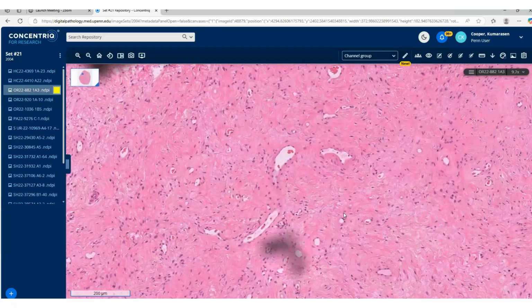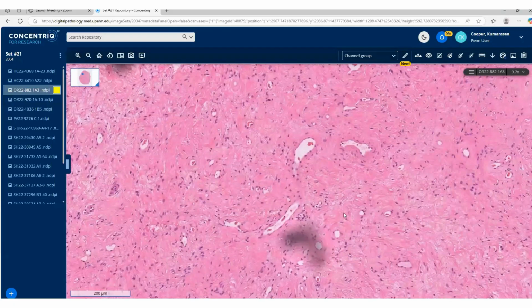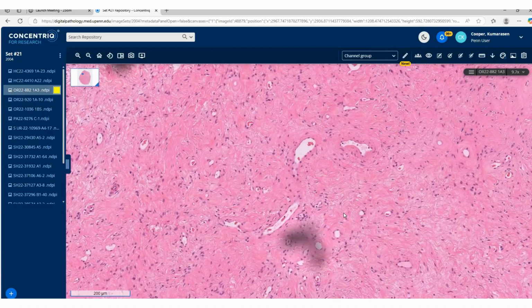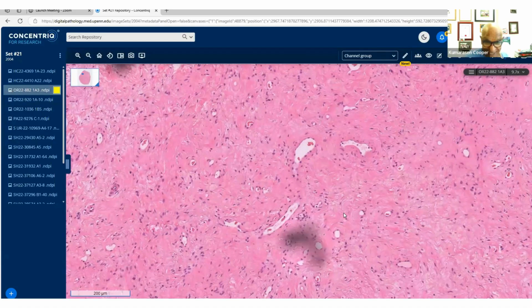Okay, so we talked... I don't know if it's just the nerve sheath. Can we do S100 and SOX10? Is it negative? Okay, negative. Of that fibroblastic, okay, we got the SFT out of the way. Smooth muscle actin is negative, desmin is negative.